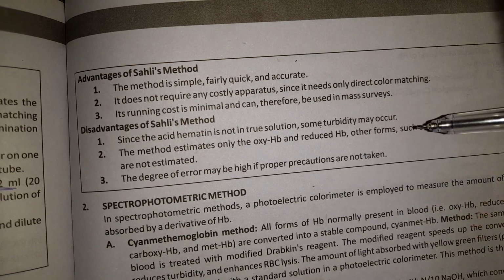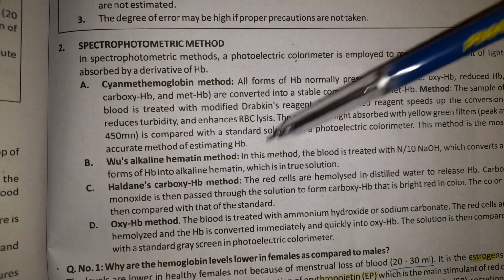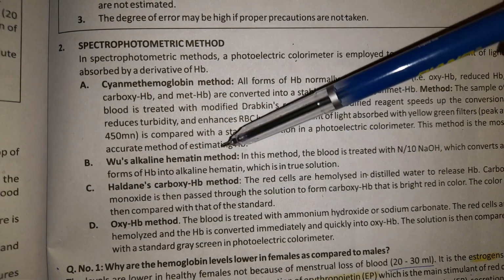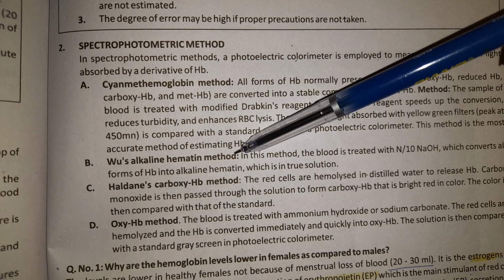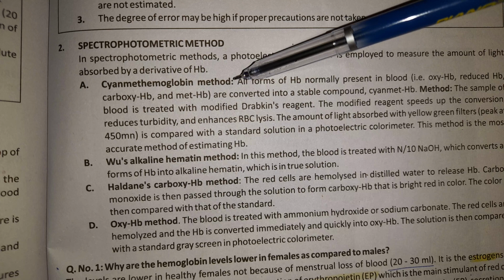For the spectrophotometric method, you need to know the names only. They are the oxyhemoglobin method, the Haldane carboxyhemoglobin method, the alkaline hematin method, and the cyanmethemoglobin method.